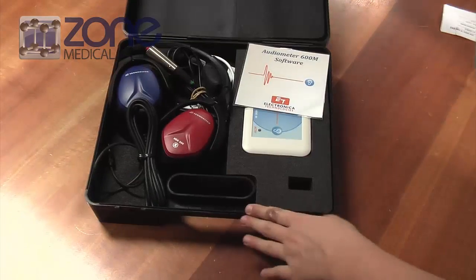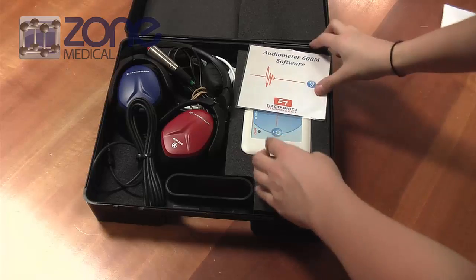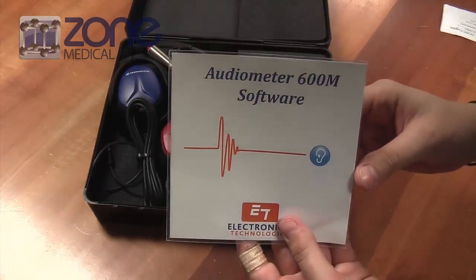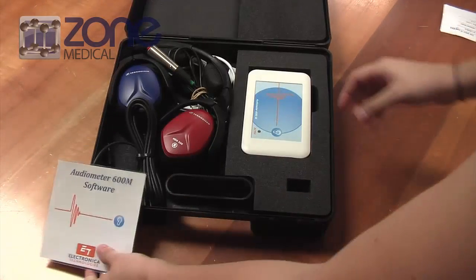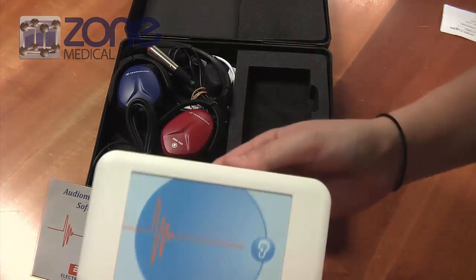Once you open it up, you'll find the CD software which you use to install it on your computer, as well as the device itself.